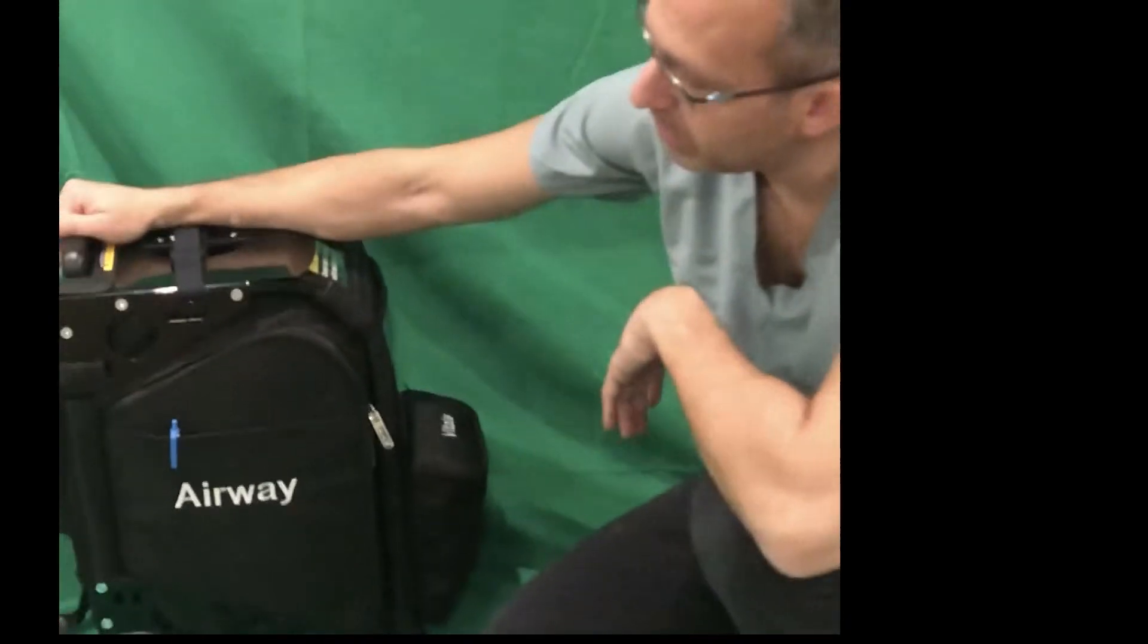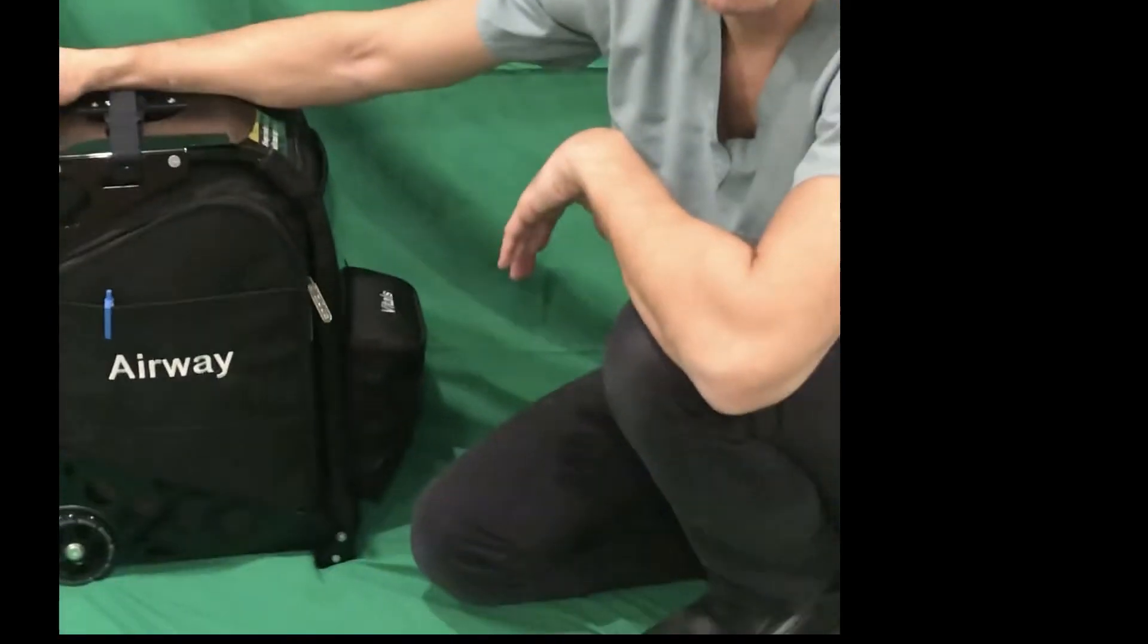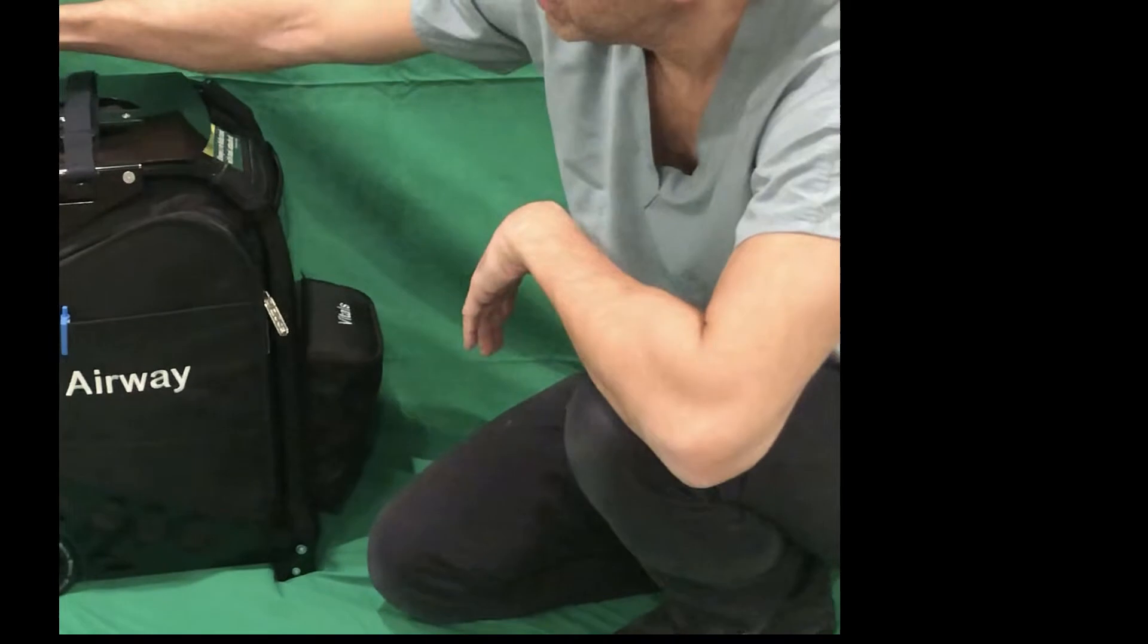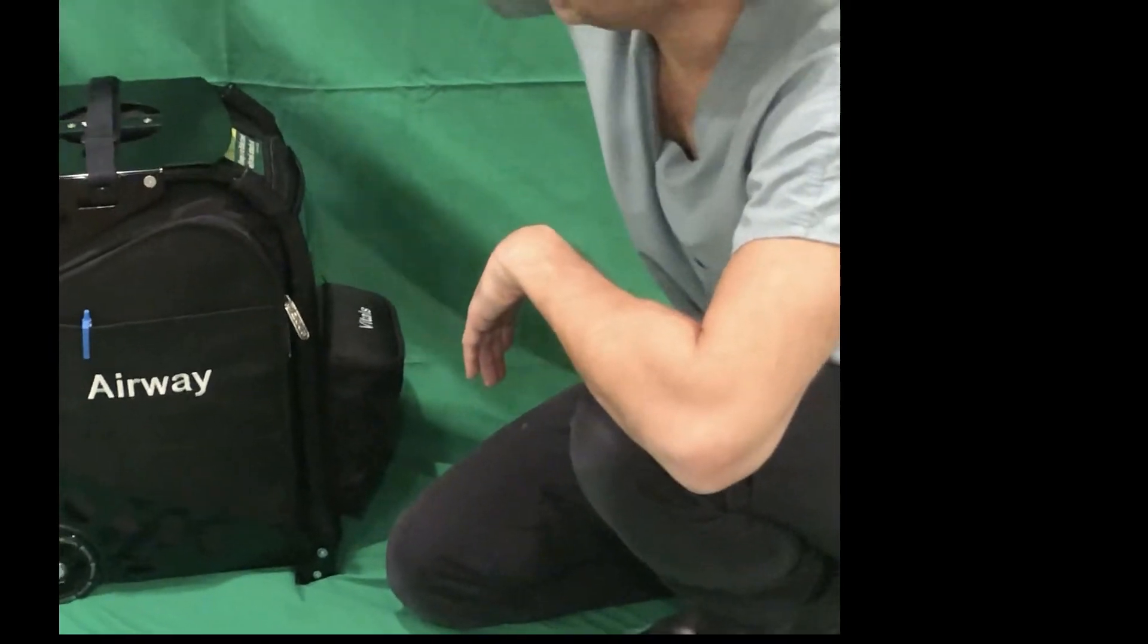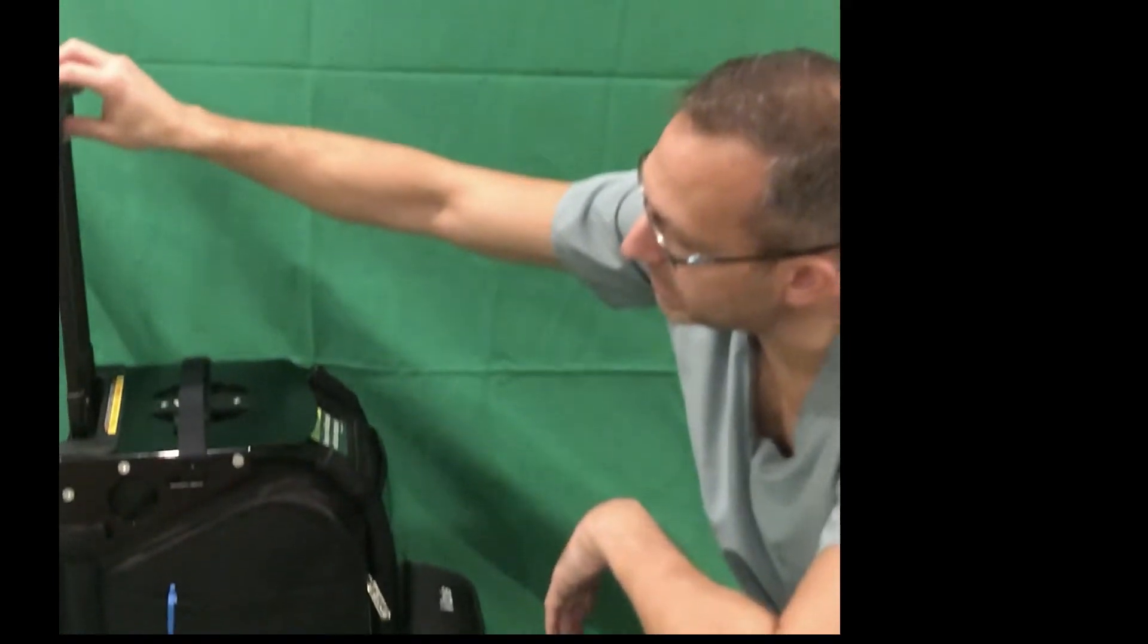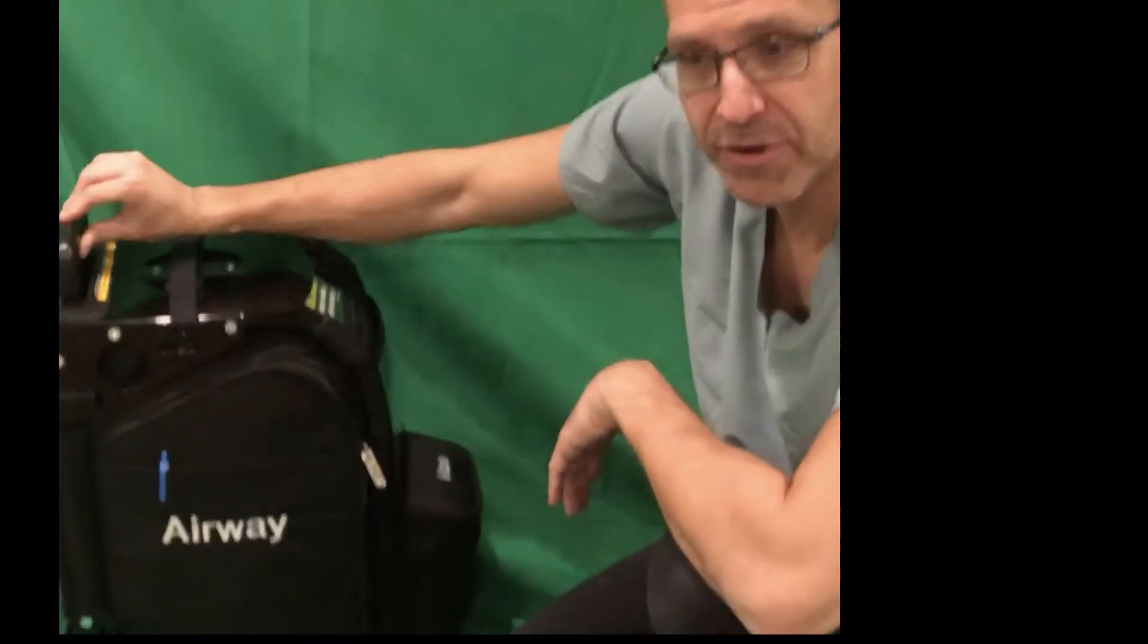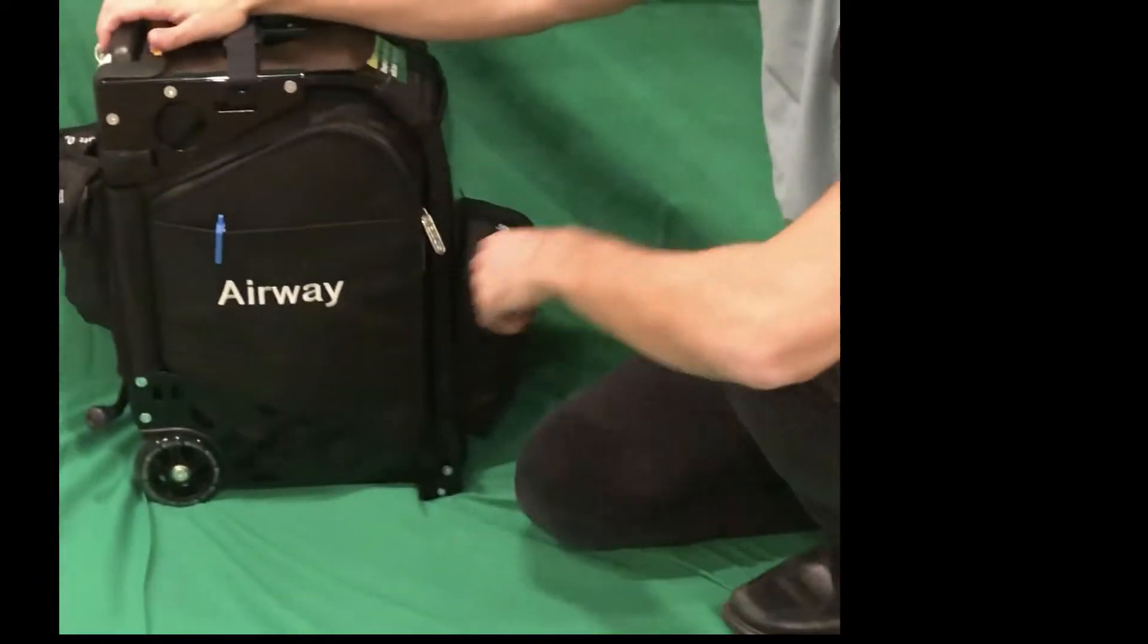This is a quick video tutorial of the new emergency medication kit that we have in the office. The first thing to review is the handle that can be elevated, and you can pull this and easily transport it from room to room.